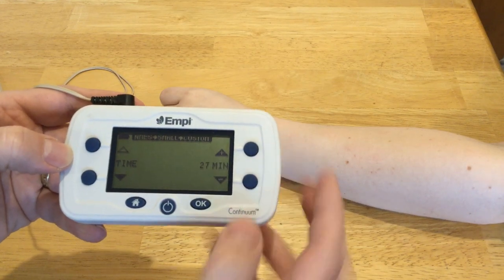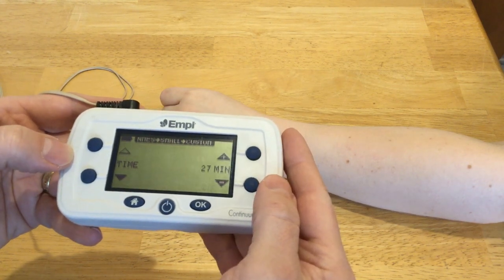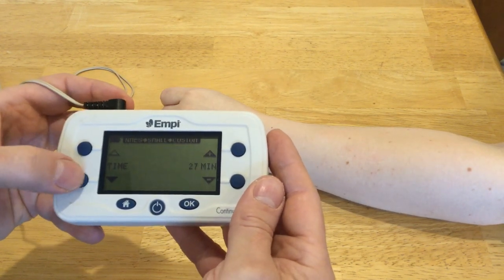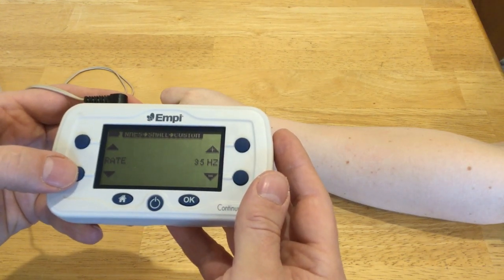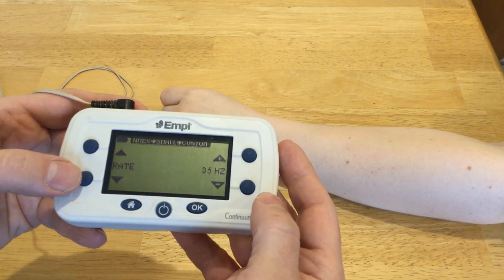So here we have time — it's set for 27 minutes, meaning the machine would just turn off after 27 minutes. That's plenty of time for us. You can use these two buttons to go through the menu. The first one was time; the next one is pulse rate, currently set at 35 hertz, which is pretty good for NMES.